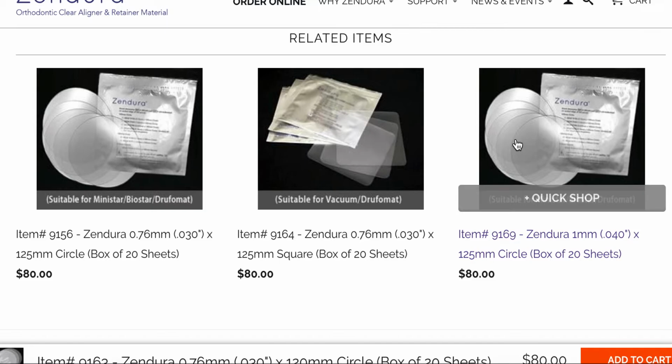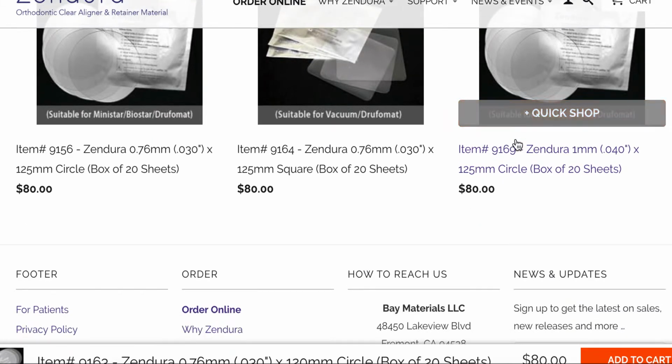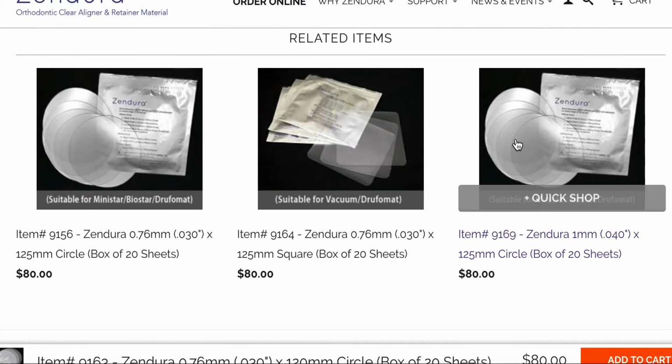I'm going to be putting on some webinars about this, and I work one-on-one with my StraightSmile Solutions clients about this. So in any case, you can kind of see the price points. These are running about $4 a sheet. This is if you buy them in bulk. The Essix is definitely cheaper. I think it's more like $1.50, $2 a sheet. Invisacryl too. I have heard not so great things about Invisacryl. You can order that from Great Lakes, that it's brittle, that it stains. So you're going to need to just try different things.